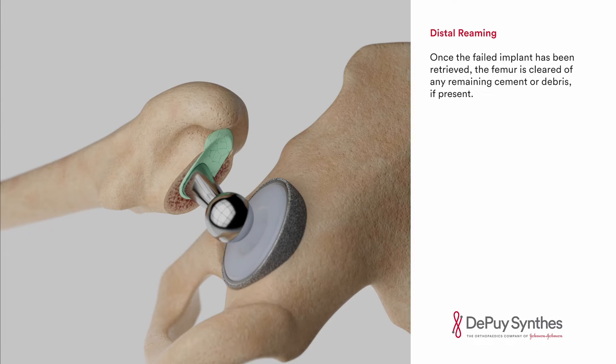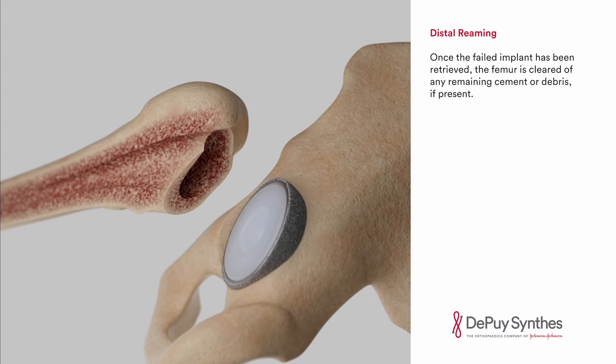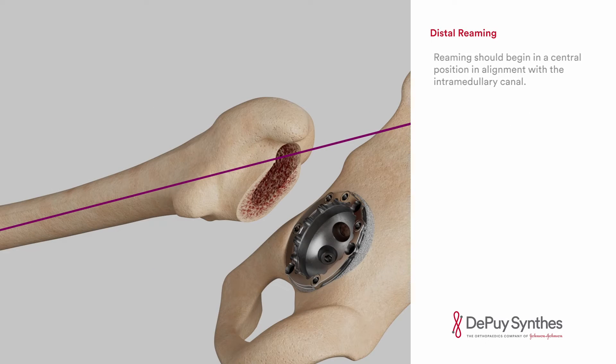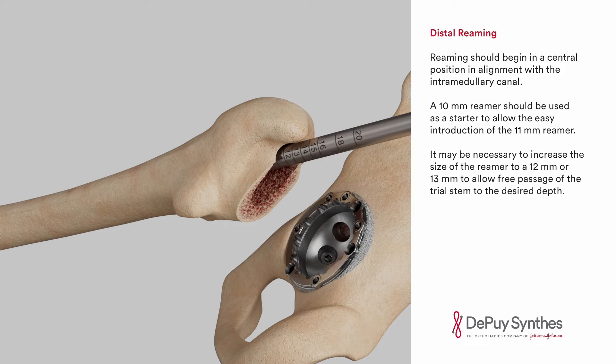Femoral Canal Preparation — Distal Reaming. Once the failed implant has been retrieved, the femur is cleared of any remaining cement or debris if present. Rigid reamers are available in a range of sizes that should be used sequentially to prepare the distal femoral canal. Reaming should begin in a central position in alignment with the intramedullary canal. A 10mm reamer should be used as a starter to allow easy introduction of the 11mm reamer. It may be necessary to increase the size to a 12mm or 13mm to allow free passage of the trial stem to the desired depth. In all cases, trialing should be performed to evaluate stem seating and stability.